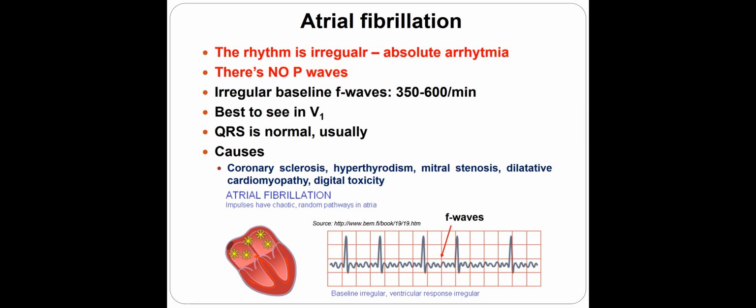Do you remember these 3 things we said so far? Arrhythmia absoluta with sinus P wave. What was it? Sick sinus syndrome. Arrhythmia absoluta with different morphology of the P waves.